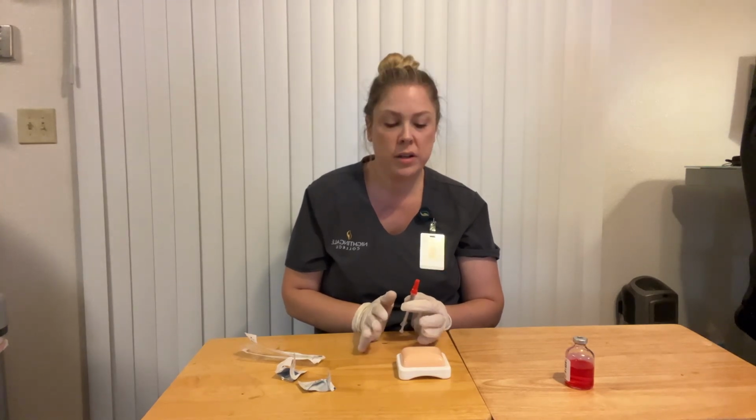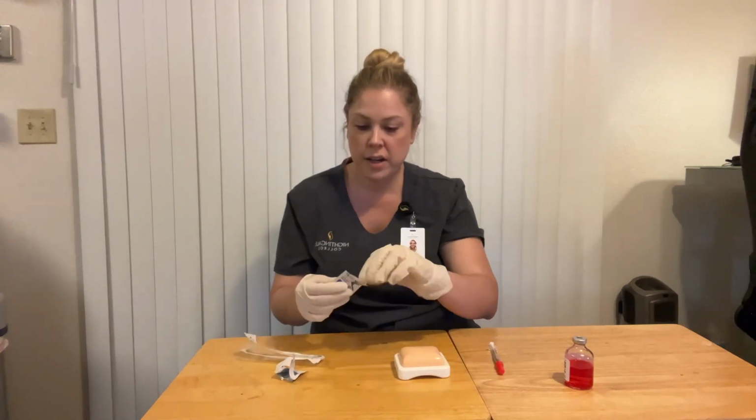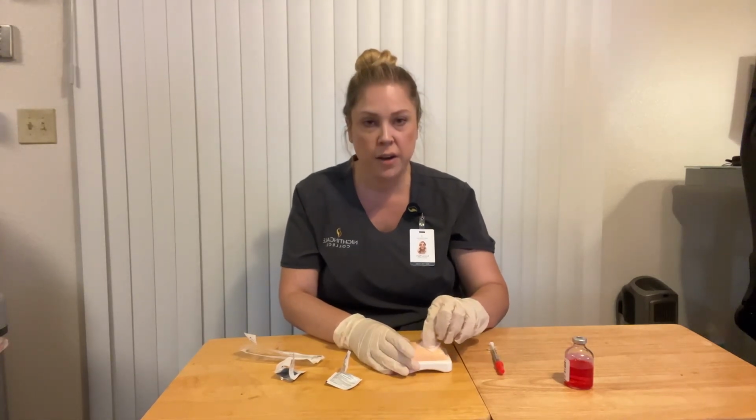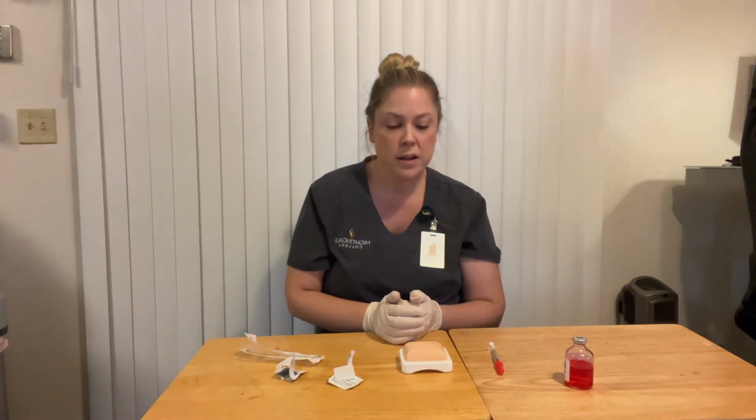So for the intradermal, we want to use the forearm, 3 to 4 fingers width below the antecubital space, and 1 hand width above the wrist on either arm. If that is not an acceptable area, we could use the upper back if needed. We would check for lesions, discoloring, or any tenderness before administering the injection. I would then get an alcohol wipe and cleanse the site in a circular motion, inside to out, about 5 centimeters. Okay. I would allow that to air dry, not blowing on it or waving to dry it.